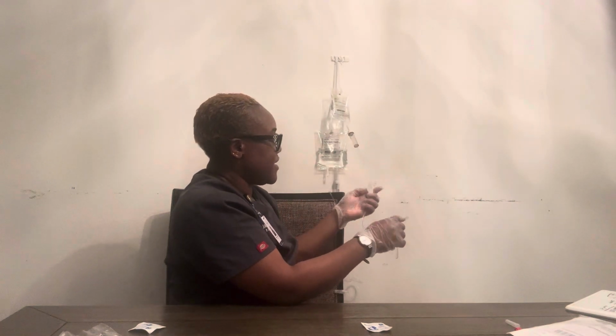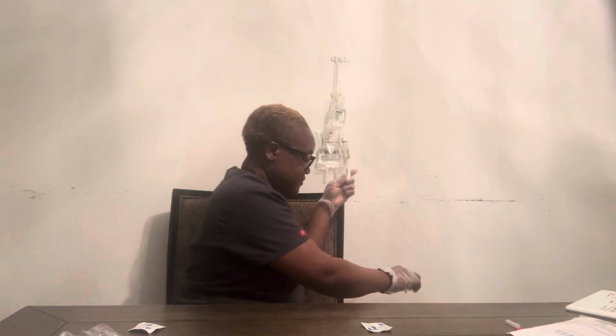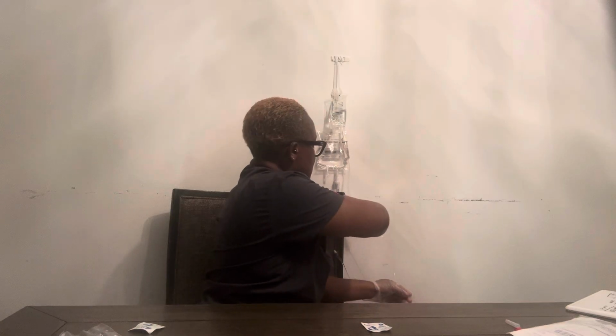So I'm gonna open my roller clamp again, slowly, and allow this to drip into my garbage can. Okay, and I'm gonna count for 1 full minute.